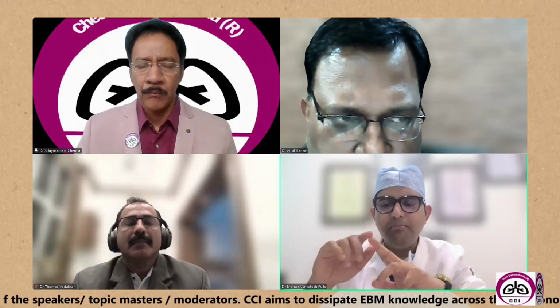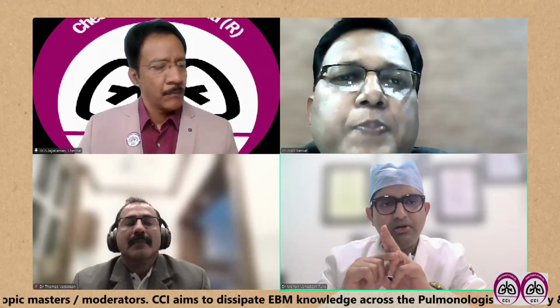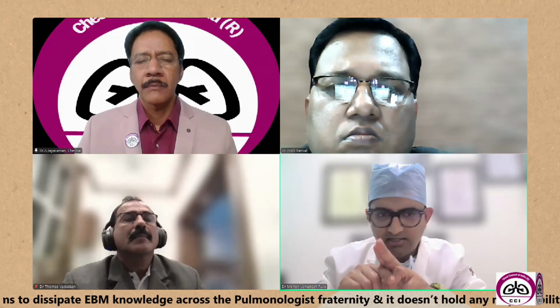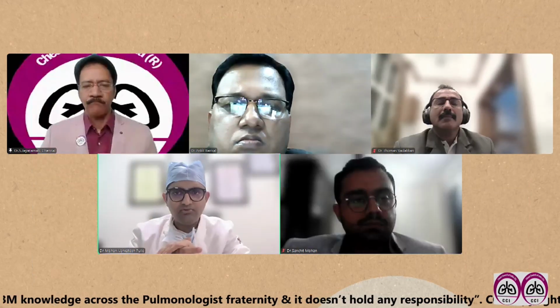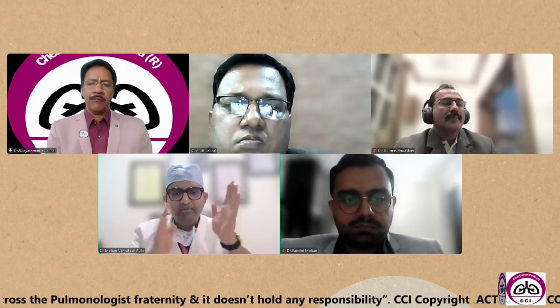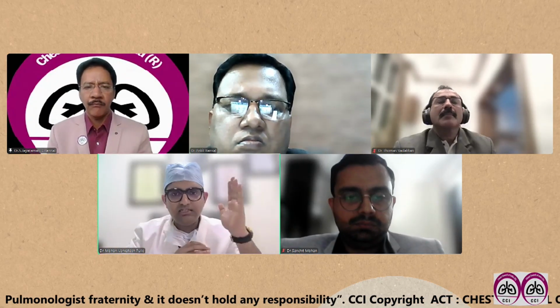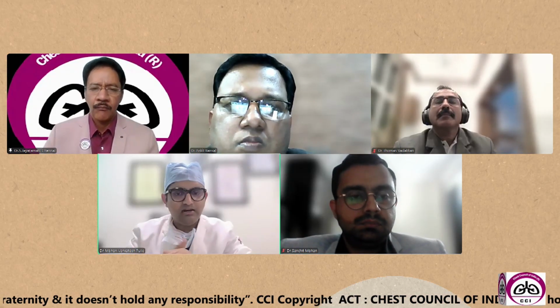That's number 1. Number 2, it's definitely less costly compared to mediastinoscopy. For mediastinoscopy, you have to take the patient to the OT. The patient should be posted in the OT, under general anesthesia, a 1 hour or 1.5 hour procedure, and it requires a special admission and all those things. So EBUS can be done on a daycare basis. It can be done under conscious sedation. Experienced people are doing it under conscious sedation.